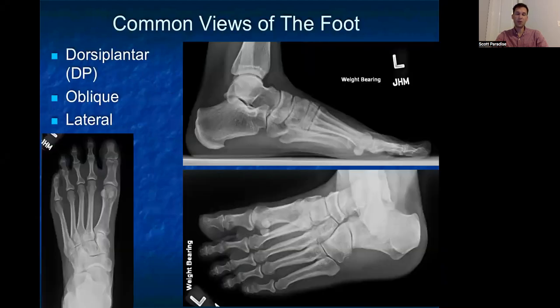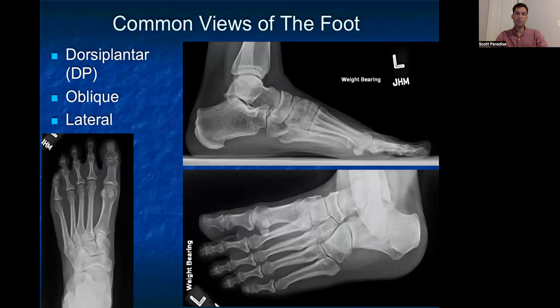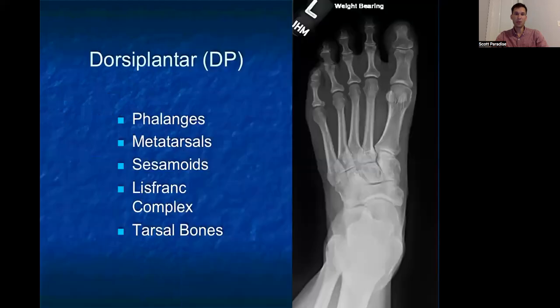We'll start with three views of the foot that are common. First is the dorsiplantar in the bottom left — this is our AP correlate. Then we're going to look at our oblique view on the bottom right and our lateral view on the top right. Just a note about these x-rays: we're always going to try and get weight-bearing x-rays if possible. These help identify the foot in its functional state and can help give a sense of inclination as well as certain injury patterns.